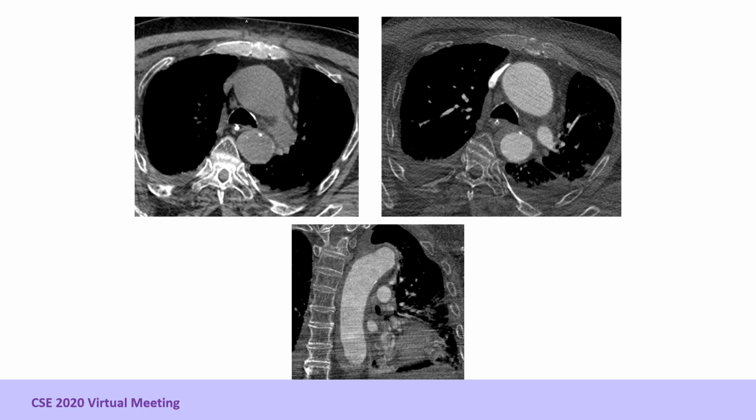this slide. In the top left, if you look closely, the pre-contrast unenhanced scan demonstrates a circumferential thickening of the aortic wall with a higher tissue density than the intraluminal blood, which is a classic finding in intramural hematoma. The corresponding contrast image is shown in the top right, where the circumferential thickening is again noted with preservation of the lumen itself. Looking at the descending aorta shown in the bottom image, one can again appreciate thickening of the aortic wall, which extends throughout the entire descending thoracic aorta.